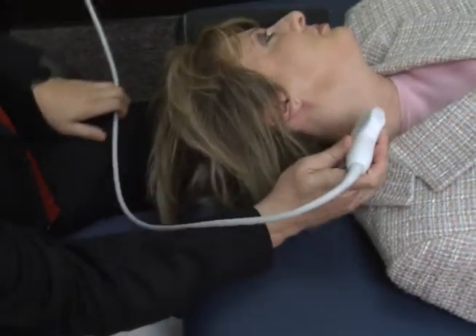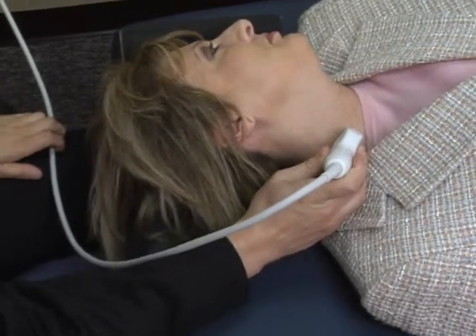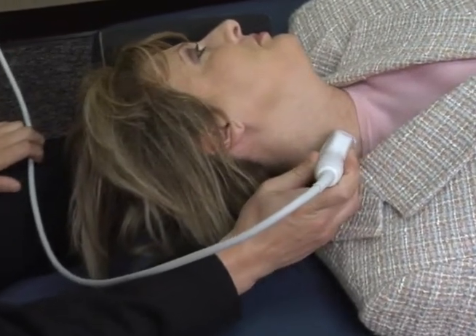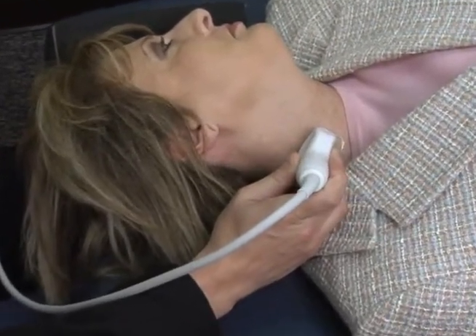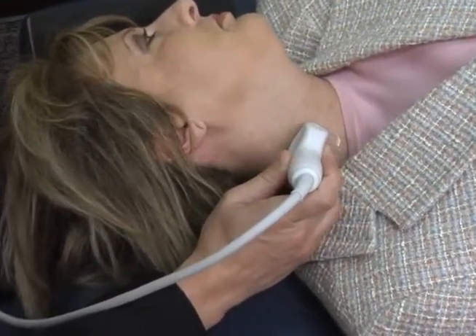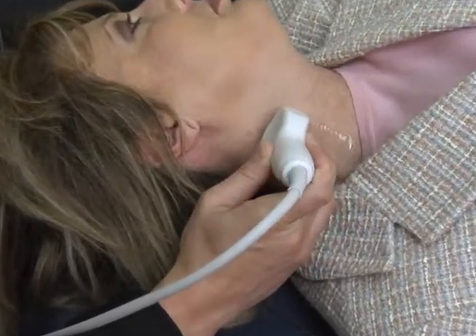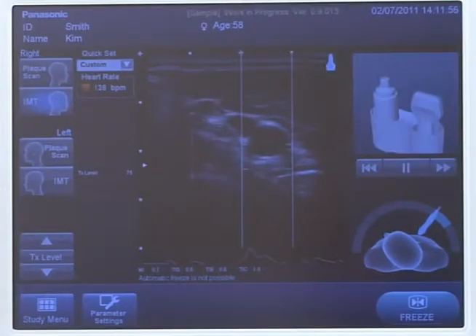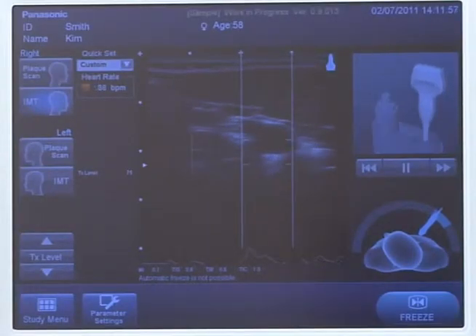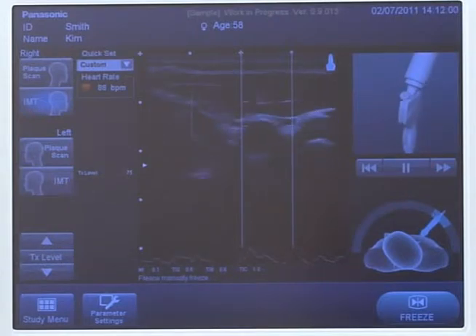Begin the exam in a transverse orientation at the base of the neck. Begin the plaque search by scanning up the neck in a transverse view. The carotid artery, which appears pulsating, should be in the center of the screen.